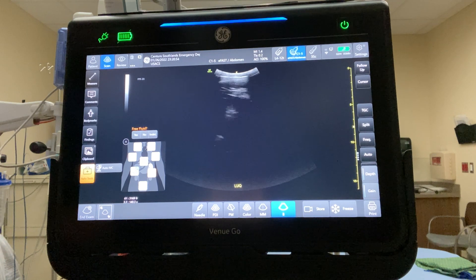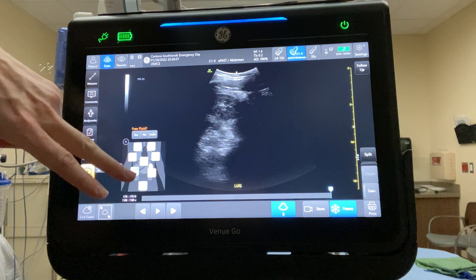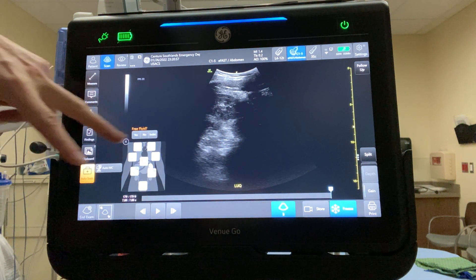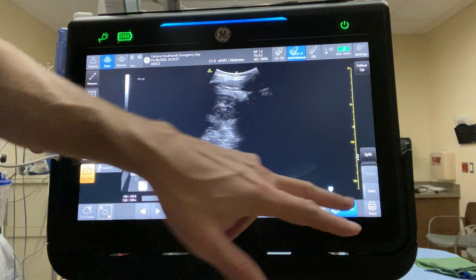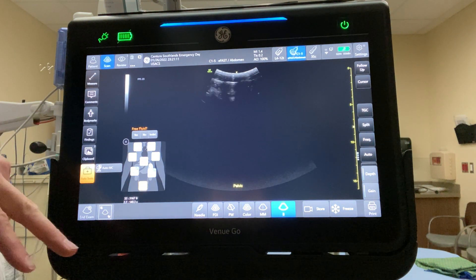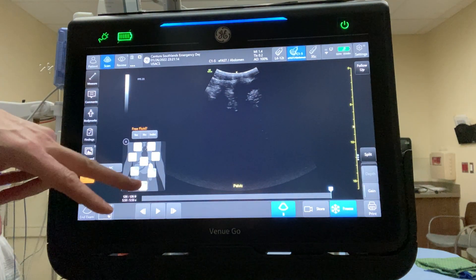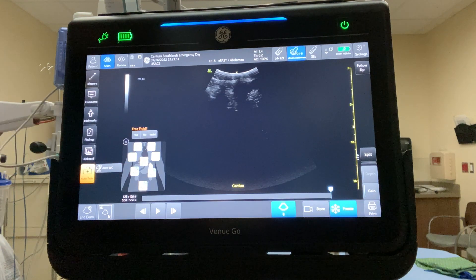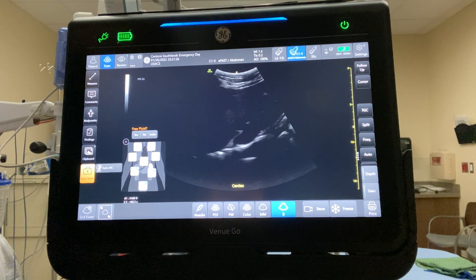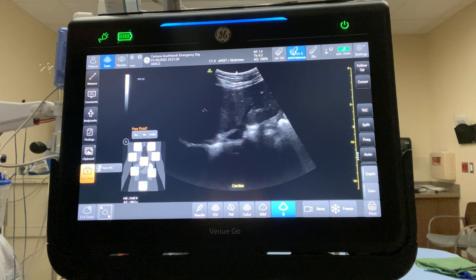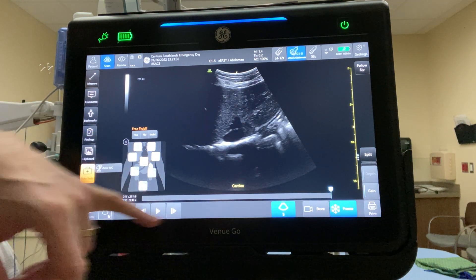Unfreeze and go through the FAST protocol like you normally would. Freeze and store — it automatically stores when you save. No free fluid. Move over the bladder, do the next scan, and store. No free fluid. Then come up and go around the heart. Get your sub-xiphoid view and it's automatically labeling it each time, then store.